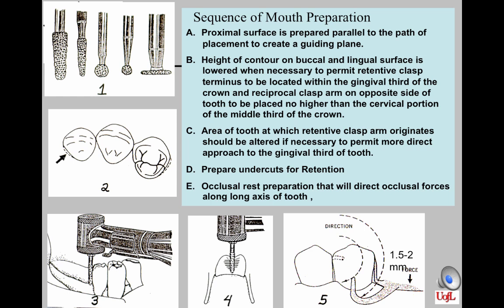And then we extend the guide plate more facial to remove tooth structure to gain some lost room in order to place a tooth in the space that offers the most aesthetic result. You must analyze and preferably diagnostically wax up the tooth setup prior to tooth alteration. You will then know what is necessary to be done to give the aesthetic result that you desire.